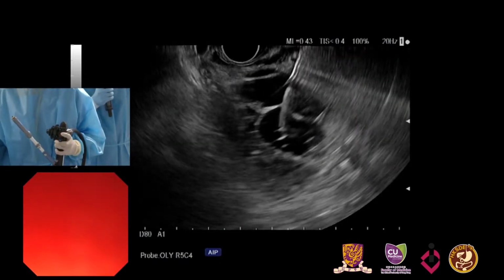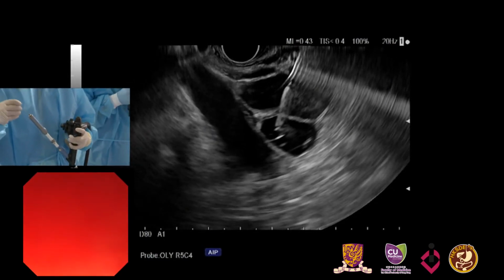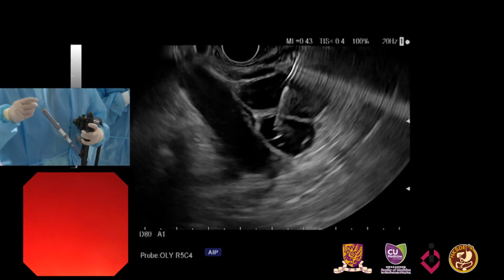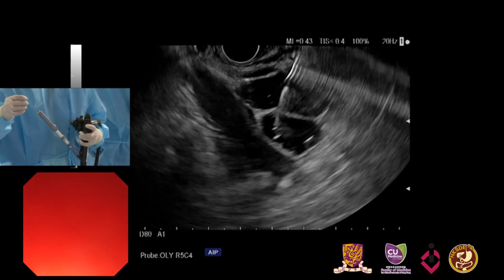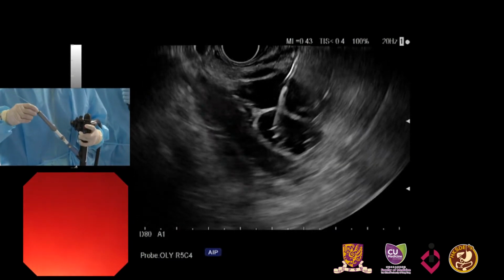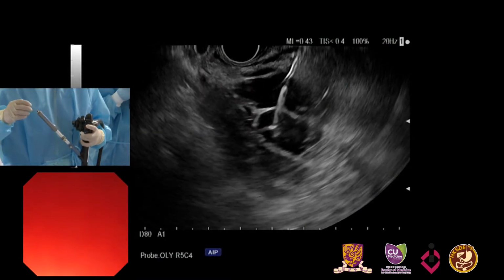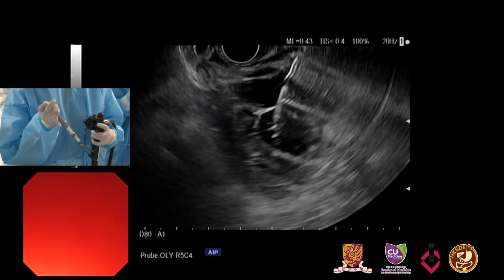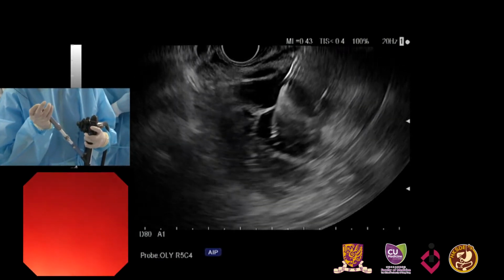About 15 years ago, when I tried to do differential diagnosis of pancreatic cyst, at that time just the EUS B-mode image was available. Many doctors and sonographers insisted that the accuracy of B-mode EUS is quite accurate and sensitive, but when I did analysis on my patients, it was quite disappointing. For differential diagnosis of pseudocysts from others, it's good. But when it goes to mucinous or serous or IPMN, the yield was not very good.